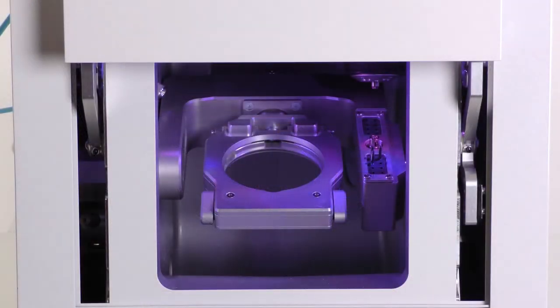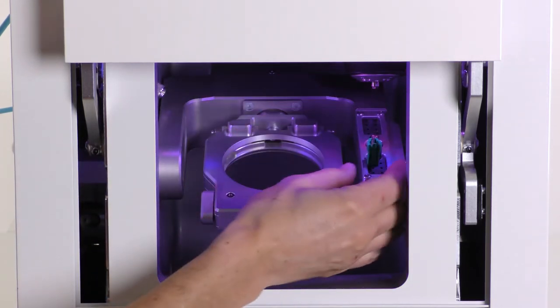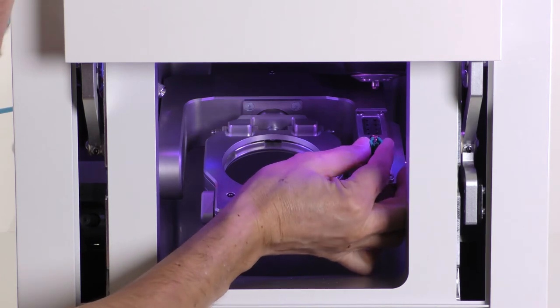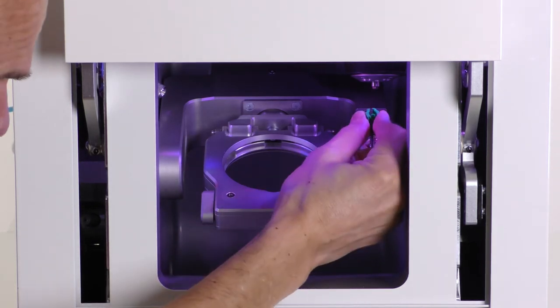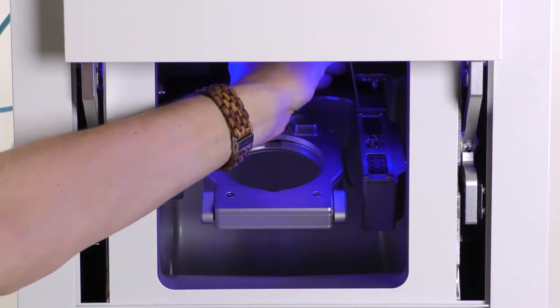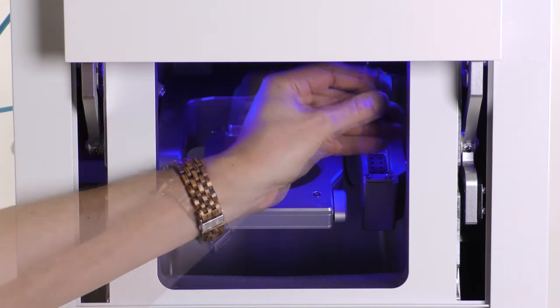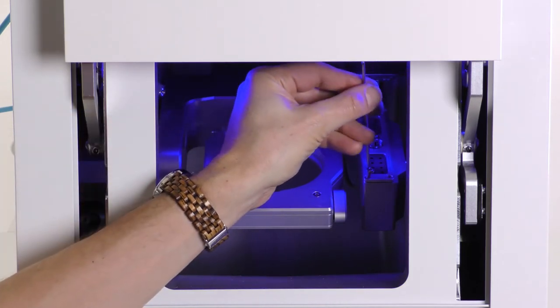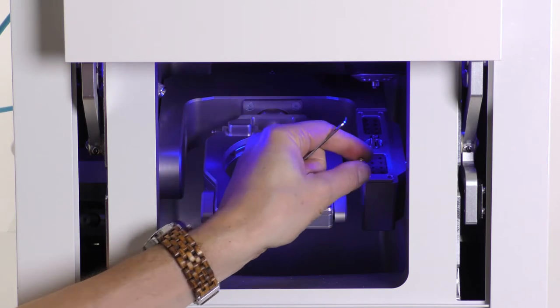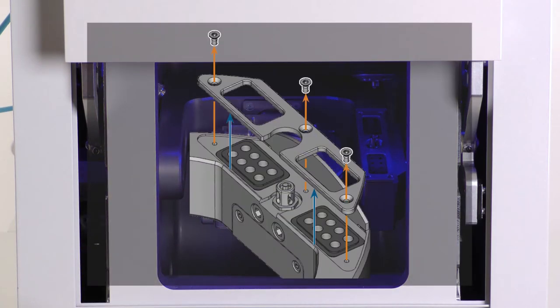If your machine is a K5 Plus, K5, or S5, do the following steps: remove all tools. For the K5 and K5 Plus, unscrew the four screws on the upper side of the tool magazine. For the S5, unscrew the three screws shown on the illustration.